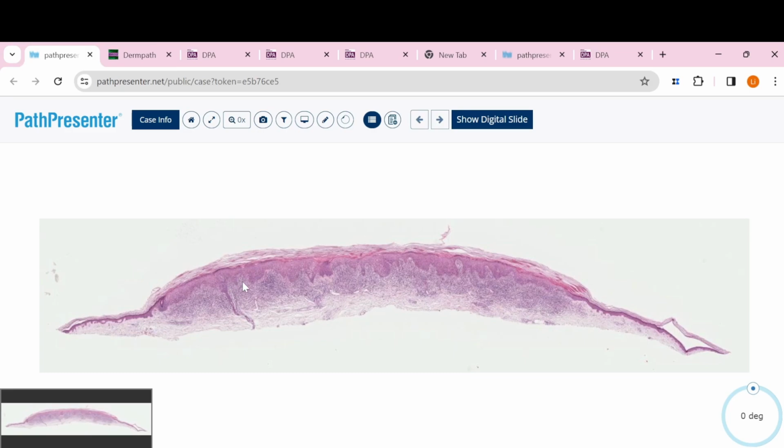If you can see really clearly between the lymphocytes and the epidermis, that is not true lichenoid change. So like this case, lichen planus, this is true lichenoid interface change because you just could not draw a clear line between the epidermis and the dermis. Of course, in low power, we can see this really dark area that should be lymphocytes.